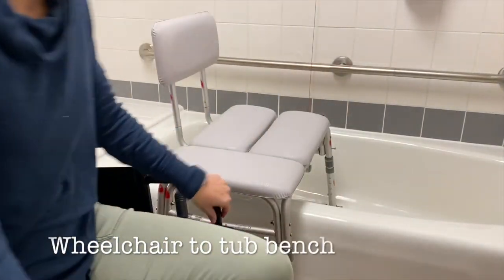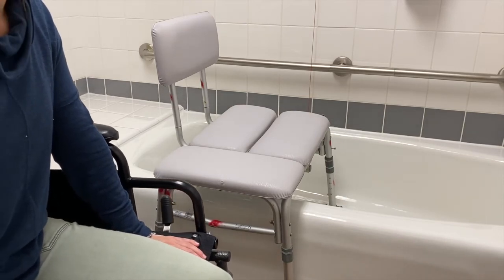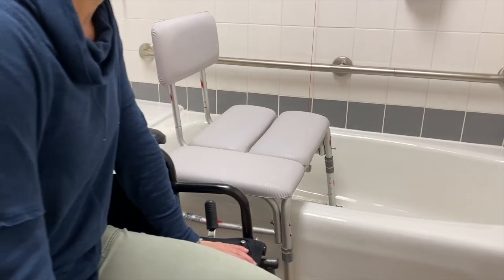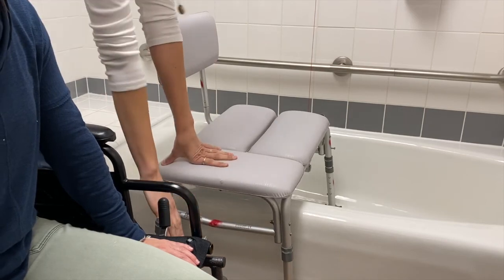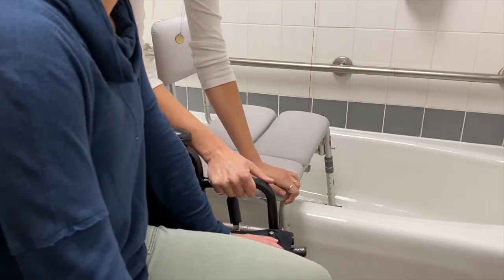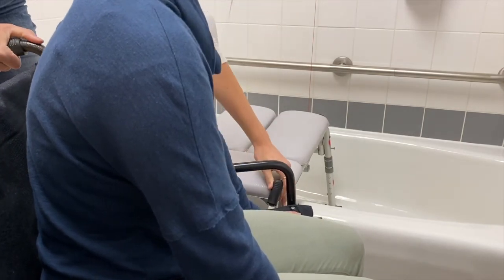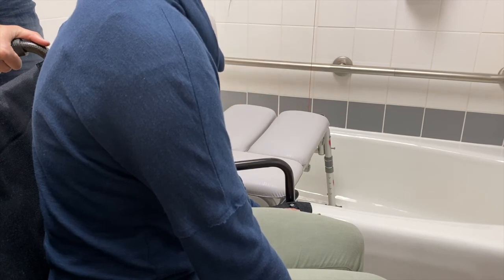The next transfer we're going to talk about is wheelchair to tub bench. This is a really common transfer that people tend to benefit from a little extra coaching. The first thing we want to talk about is where the front leg of the tub bench should go relative to the wheelchair — it should ideally split between the large wheel and the front caster, angled in this way. I'm going to lock the brake, and oftentimes when you lock the brake it pushes you out of position, so after locking the brake I'm going to pivot Kelsey back toward the tub. We're at that 30-degree angle and we have both wheels split with that front leg of the tub bench.